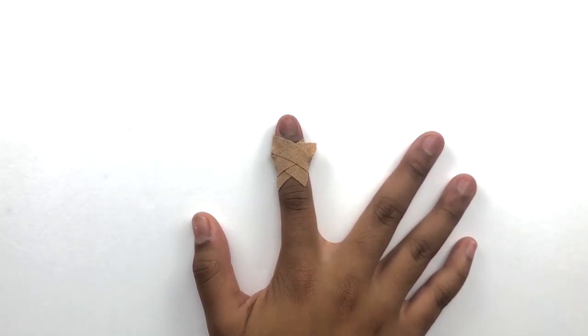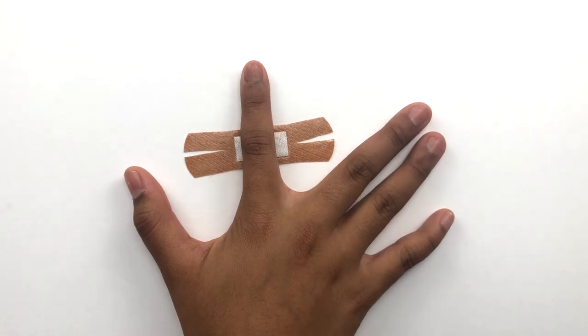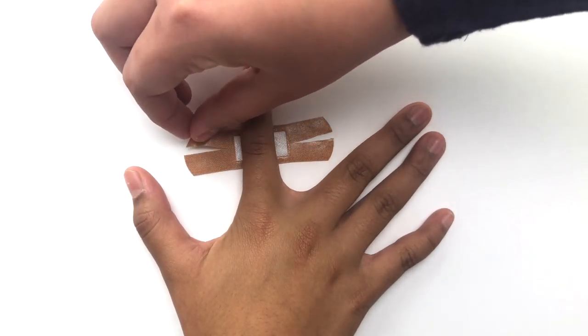This is what it should look like. For your knuckle, repeat the steps except when folding the flaps, crisscross like so.